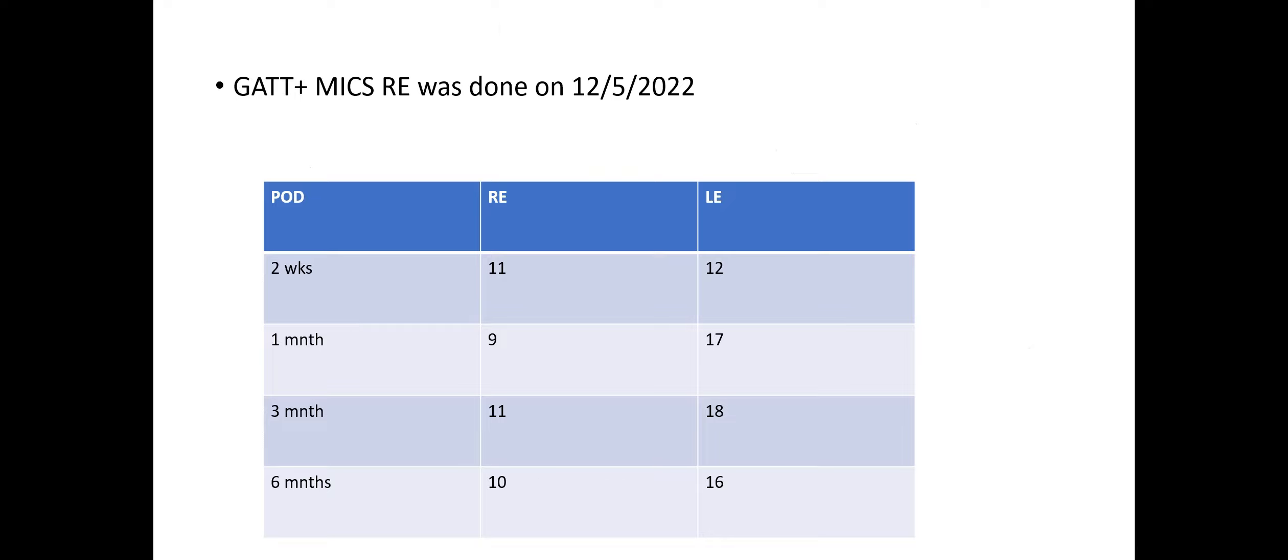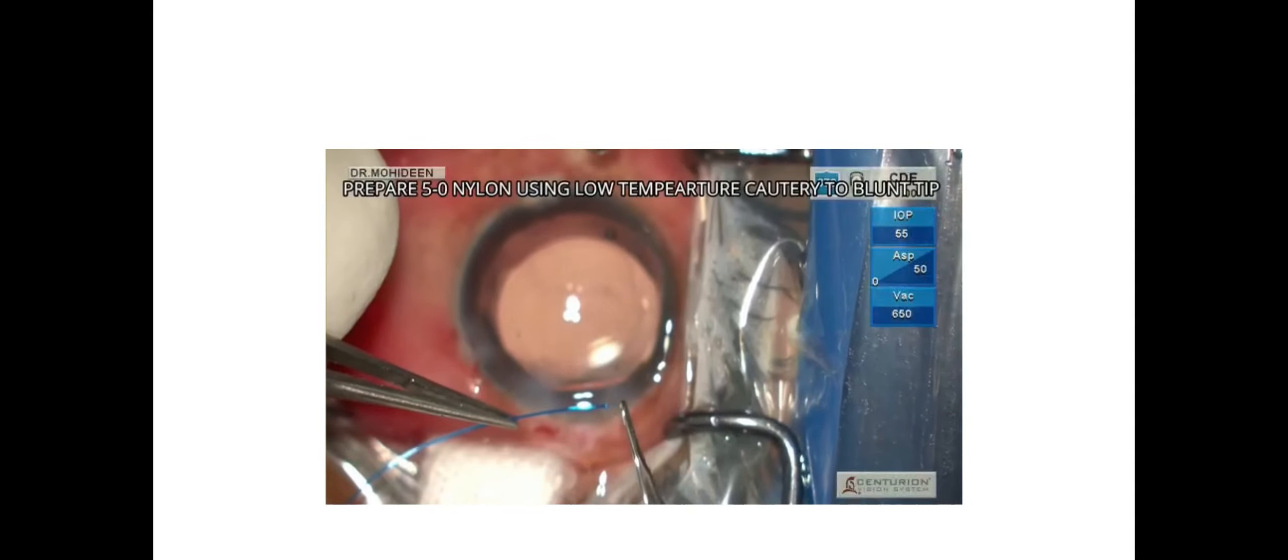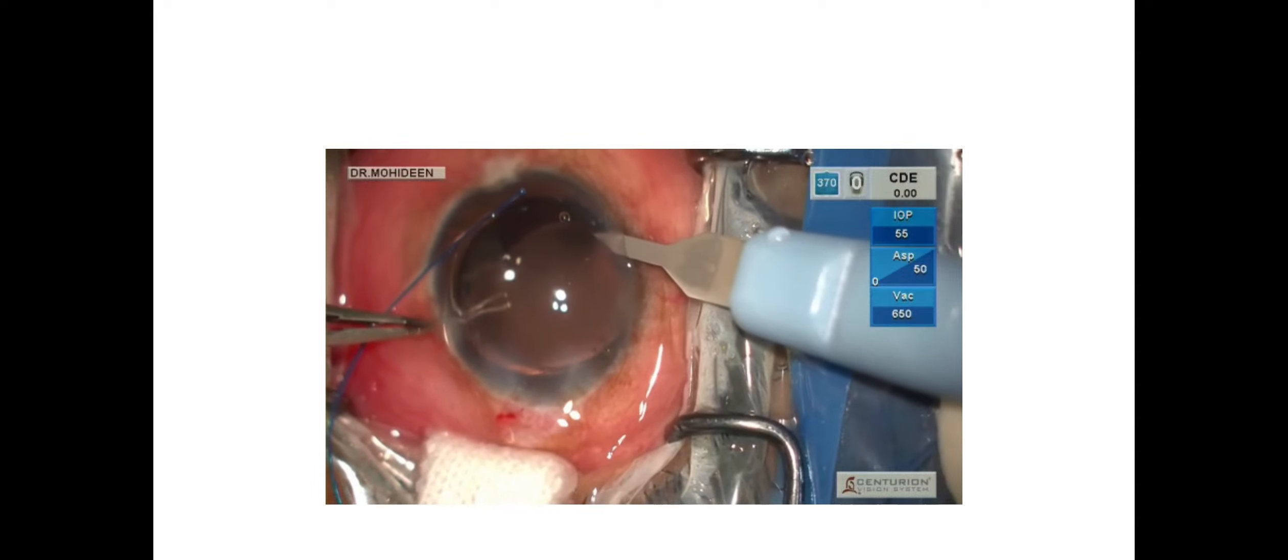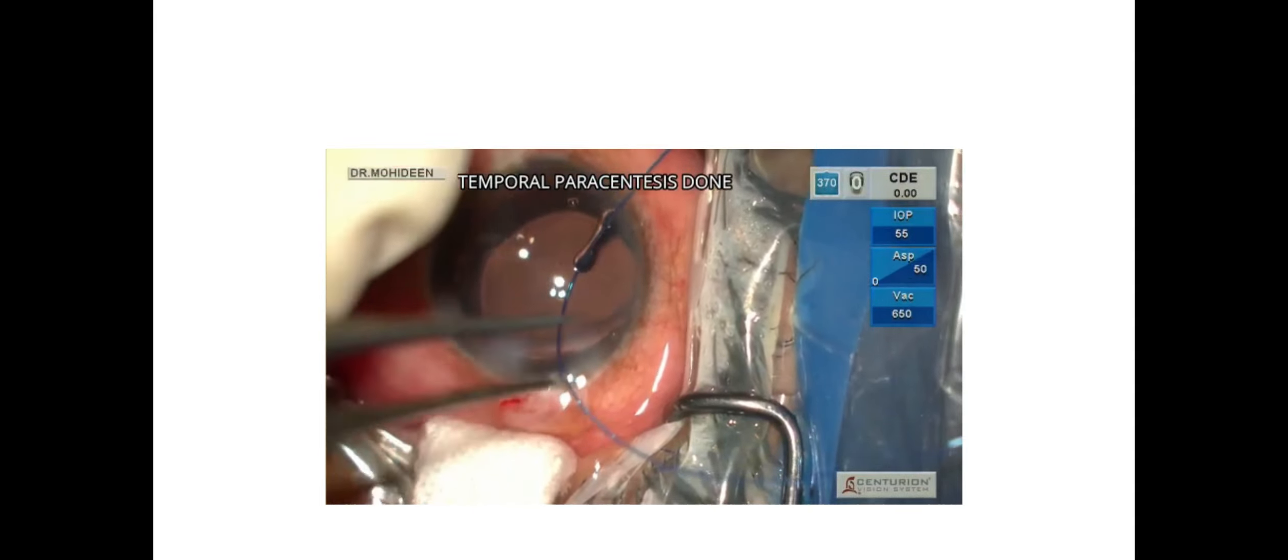This patient underwent gonioscopy-assisted transluminal trabeculotomy with phacoemulsification in the right eye and the intraocular pressure control was really good. This is a video showing the GATT procedure being performed in the right eye of the patient.